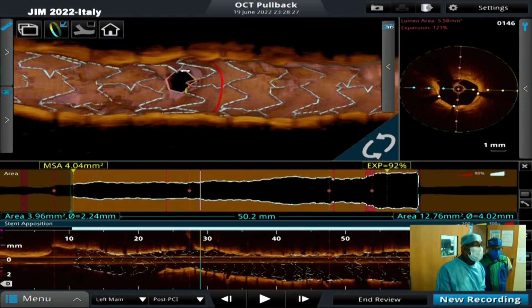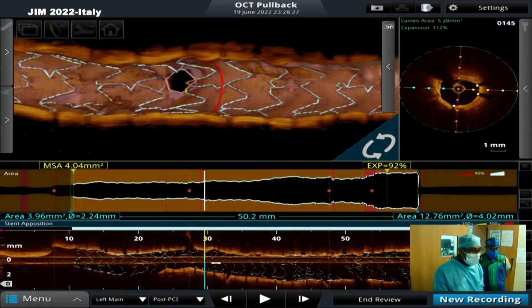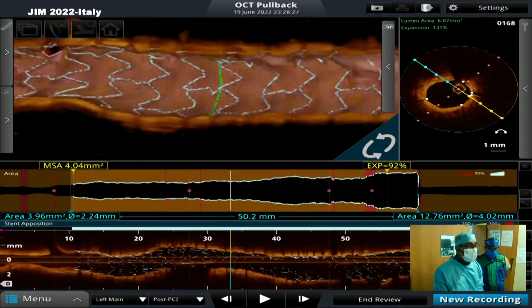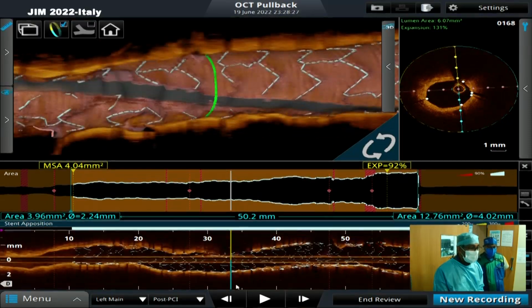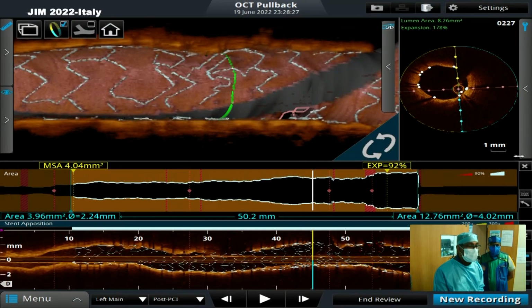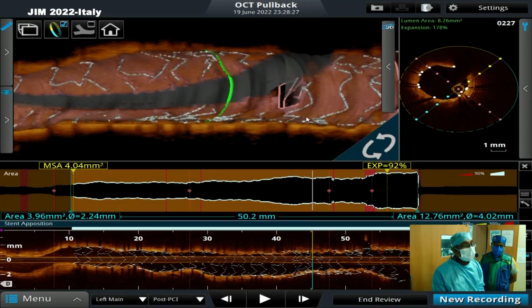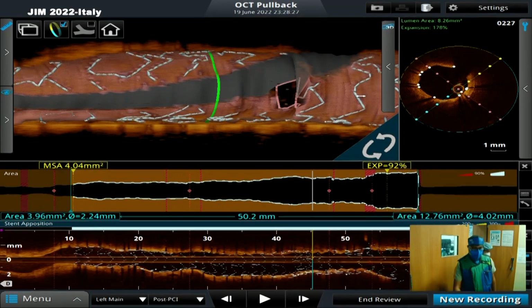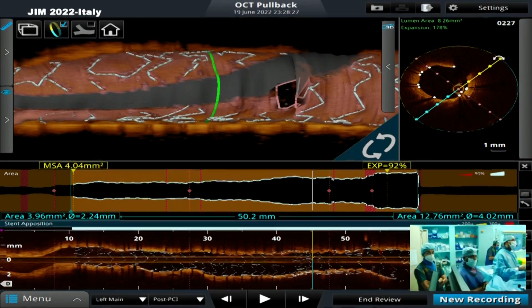You did a great job. No need. There is one diagonal ostium over here, which looks really good. Then as we come more proximally, precision, that's what I call it. The position of the struts is unpredictable, however. It's a tremendous precision, and that is again at another diagonal. So the diagonal ostium looks really good. Great.